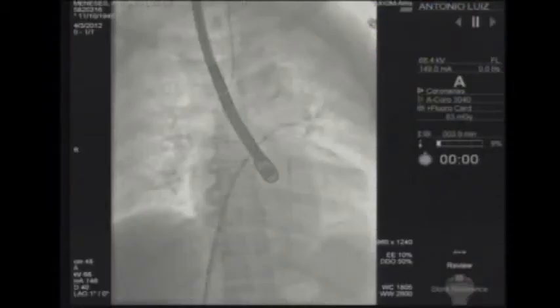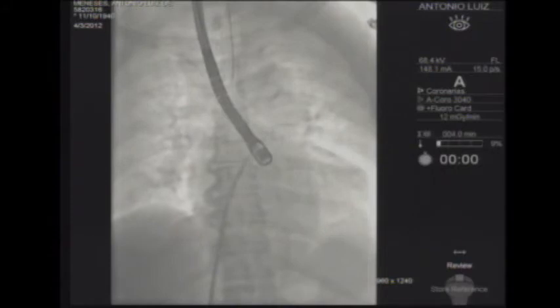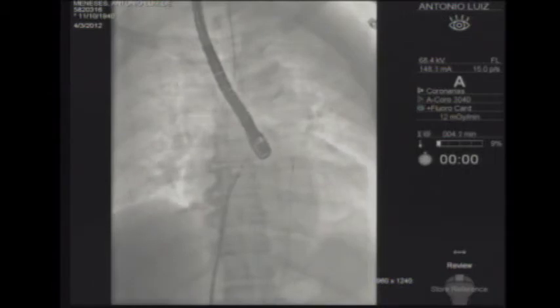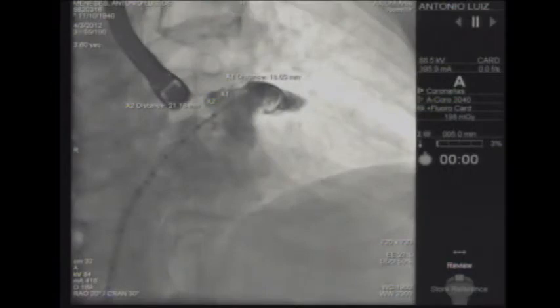If there's a catheter in the left atrial appendage, I think, in the left upper pulmonary vein. Yeah, so it's the left upper pulmonary vein. It's a little bit dilated. So I'm going to rotate a little bit counterclockwise to see if it goes anterior. So it's still in the left upper pulmonary vein. There. Okay. So let's show some cines, some measurements.